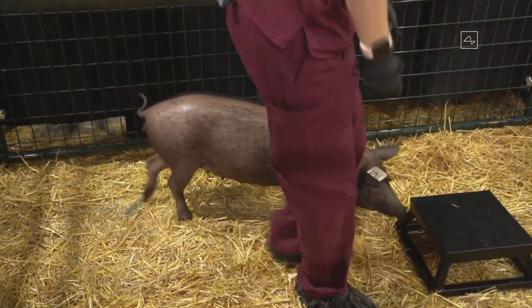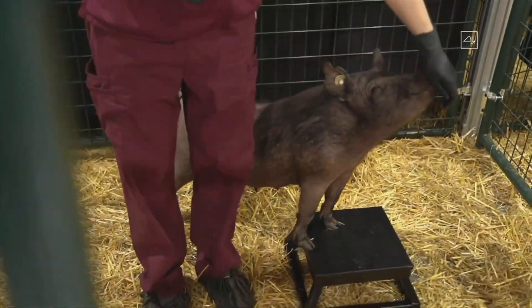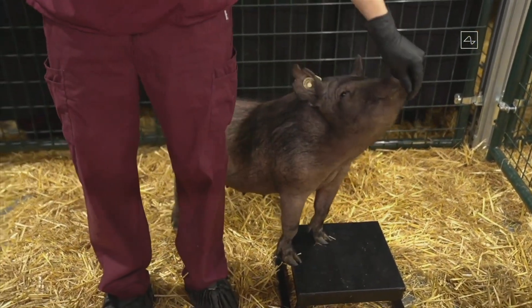What we have in pen number one is Joyce, and she does not have an implant. Obviously healthy and happy.